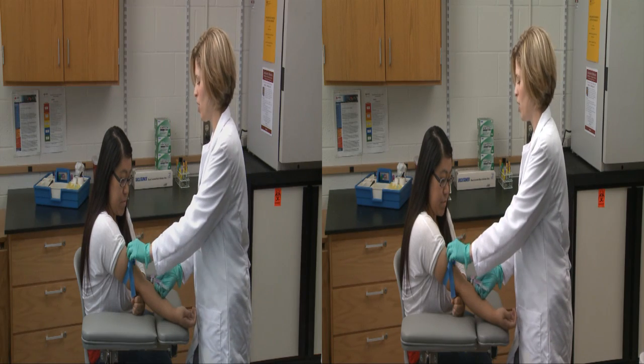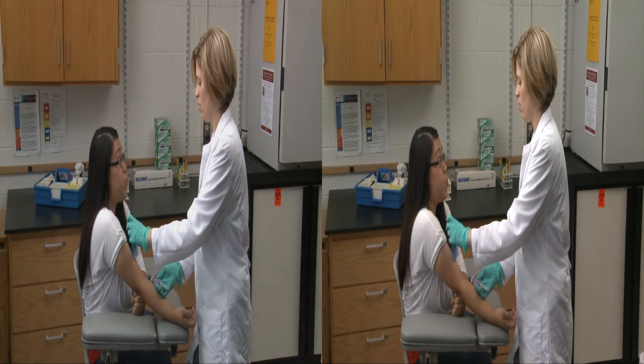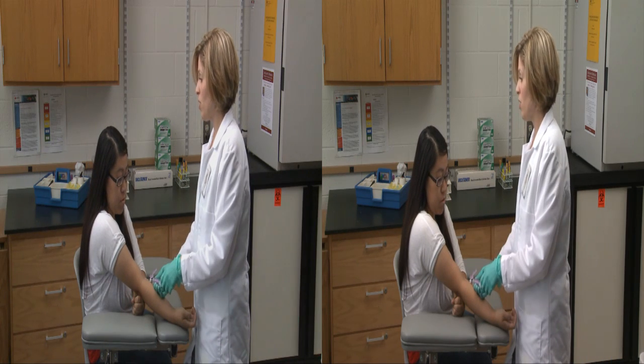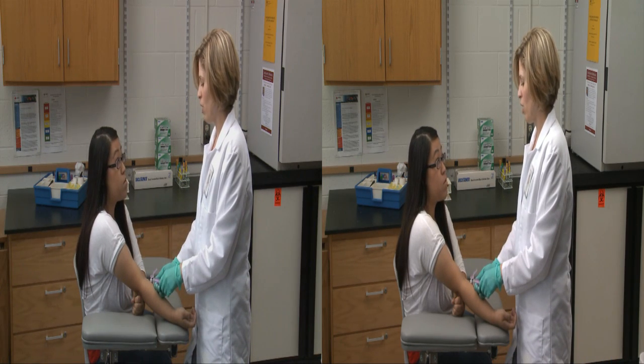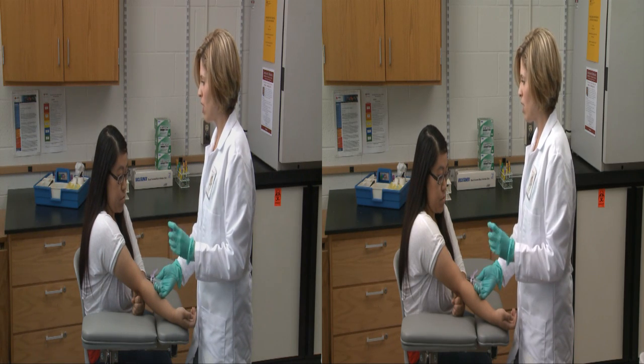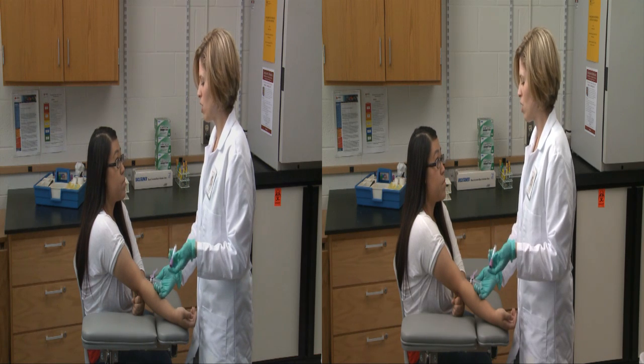We're almost done here. This is the last tube I need to draw. When will I know the results? I'm kind of anxious about them. Your samples will go over to the lab today and your doctor will notify you after the results are in. You don't see them? No, I don't. The samples that we draw today are tested by laboratory professionals who relay those results directly to the physician.